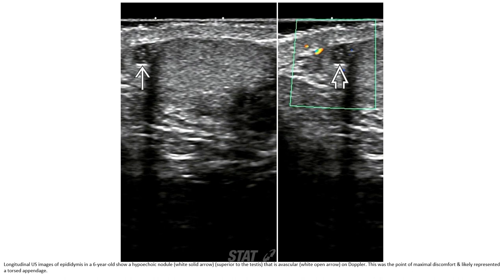Another case of a six-year-old. Ultrasound shows a hypoechoic nodule. There is no vascularity on Doppler. This was the point of maximal discomfort, consistent with an acute torsion of the appendix.